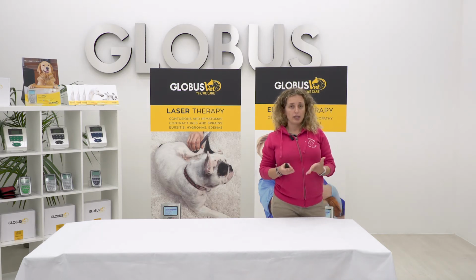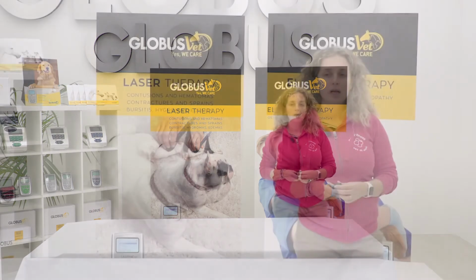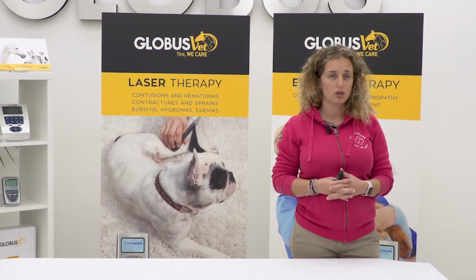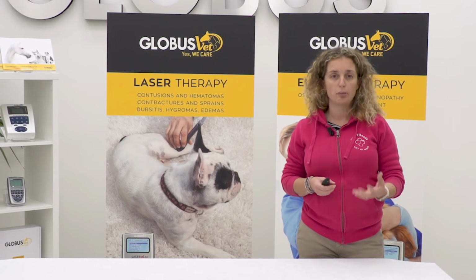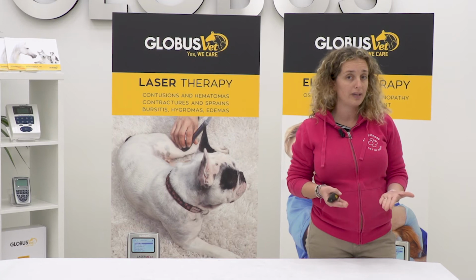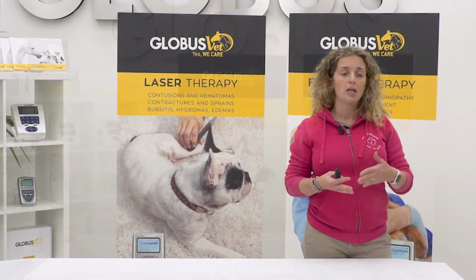We have chosen TECAR, and used it on the most painful joint because, compared to laser, with which it shares many beneficial effects, TECAR has a greater analgesic effect, an effect that is remarkable, extremely rapid, to the point that the owners immediately notice the effectiveness after 1 or 2 treatments, noticing the improvement in the well-being of their dog.